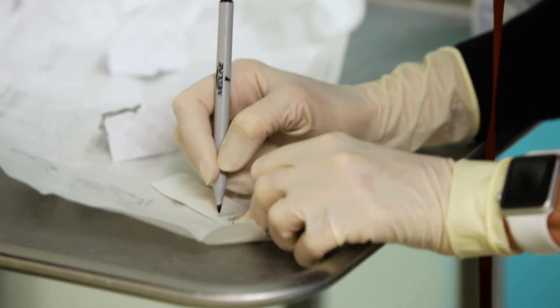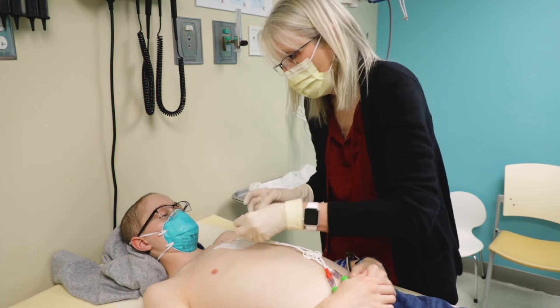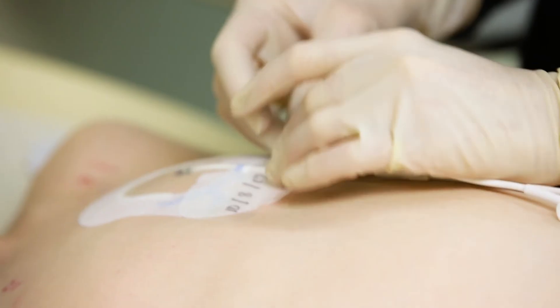Write the date you changed the dressing on tape and stick it on the dressing. That way, you won't forget when you changed it.